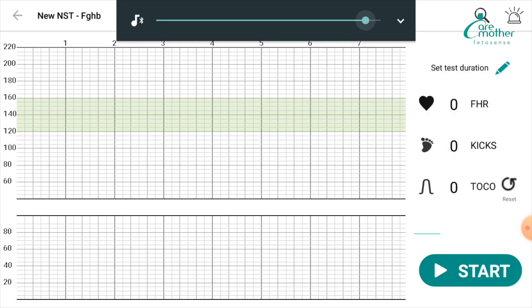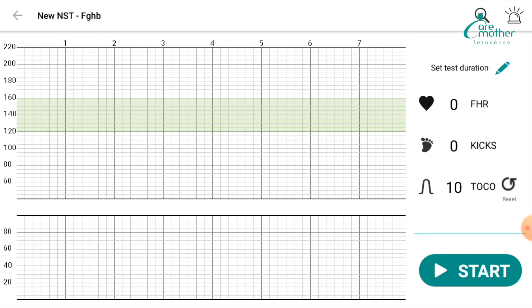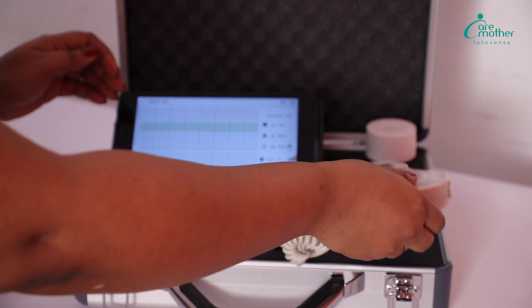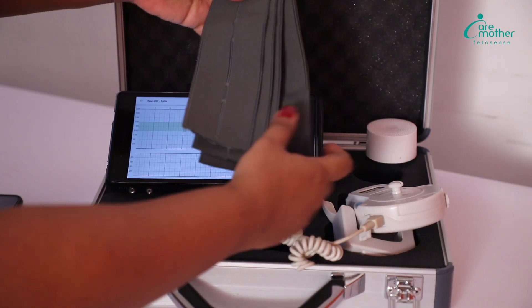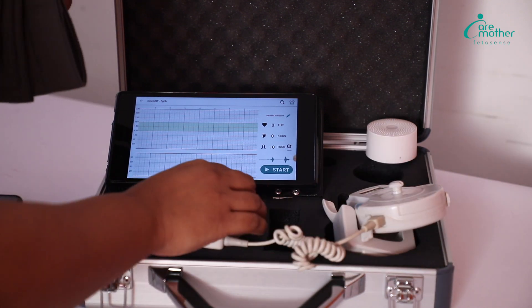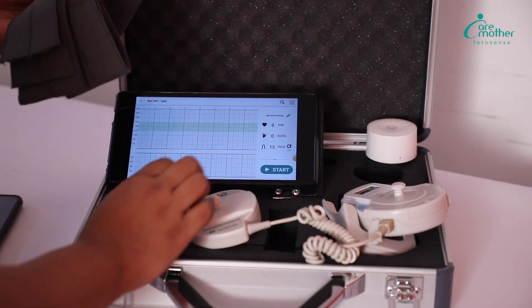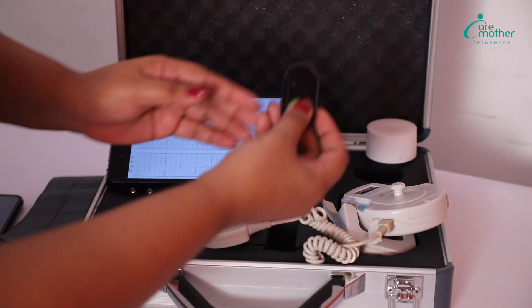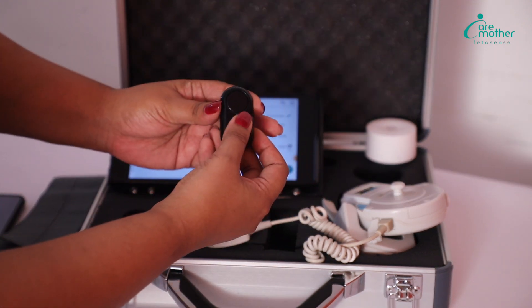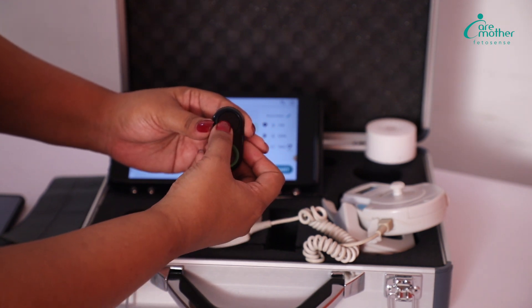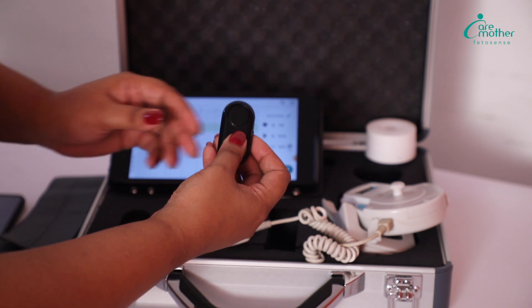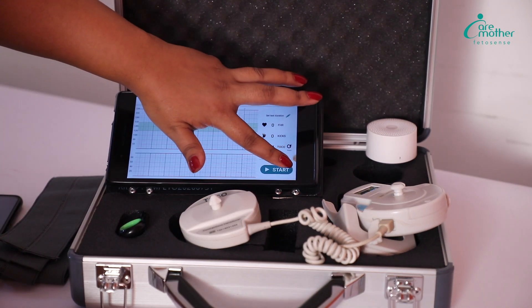Once all devices are connected via Bluetooth, we come to the test screen. At this stage, we strap the FHR probe onto the patient using the belt. This belt will be used to strap the FHR probe and, if required, the TOCO probe to the patient. Then we give the movement marker to the mother and ask her to place her thumb on the button and press it whenever she feels the baby's movement.